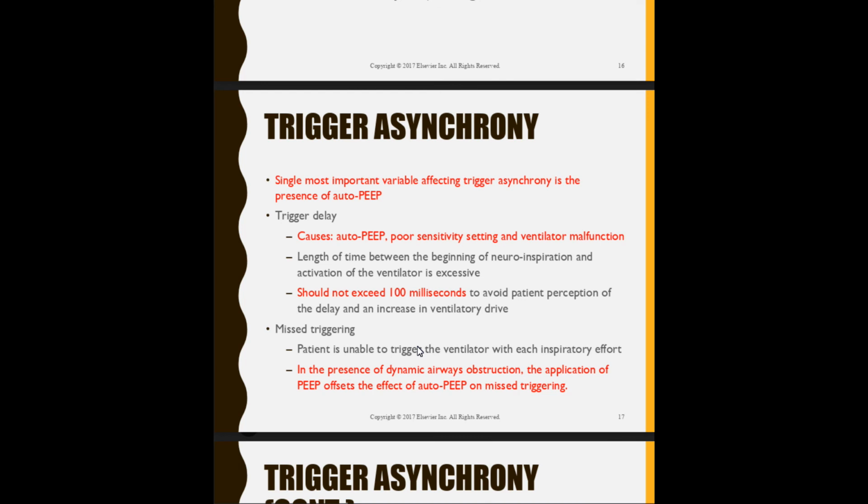When we talk about dynamic airways, we're talking about the breath or air that's constantly moving versus static. If I have a static airway, I have no air movement, but there's a pressure. That's where your plateau pressure comes in.